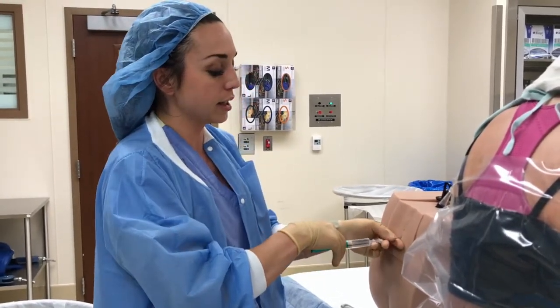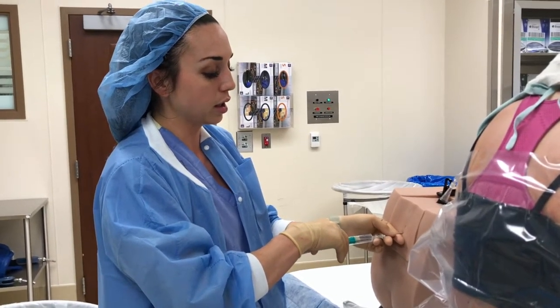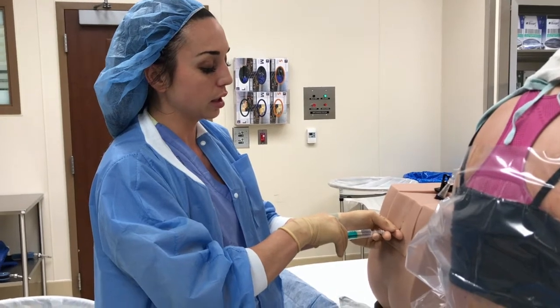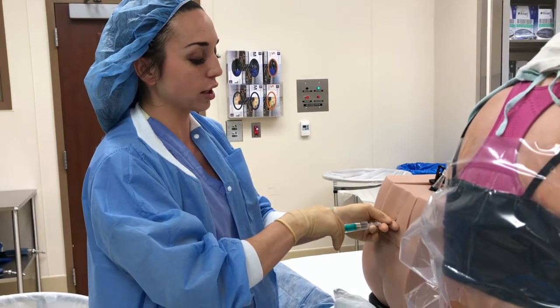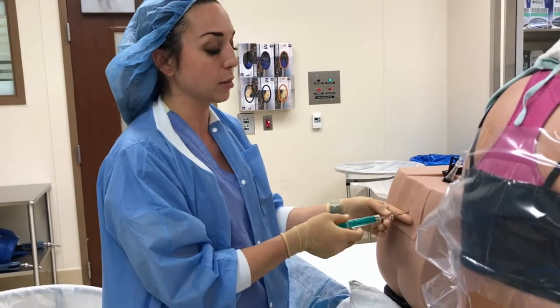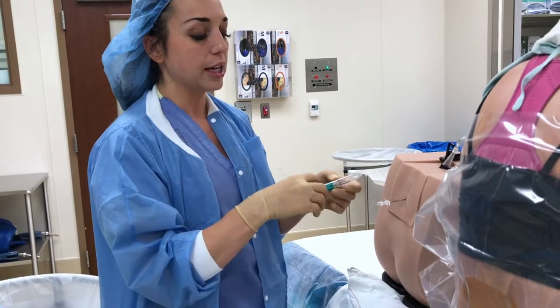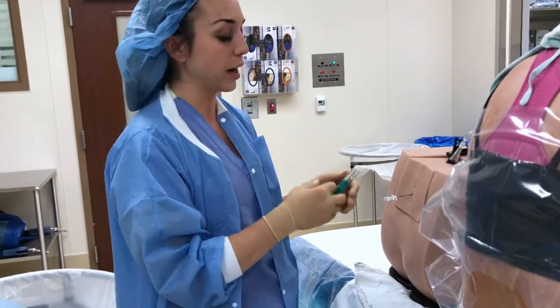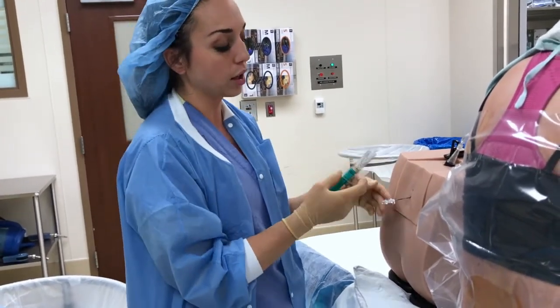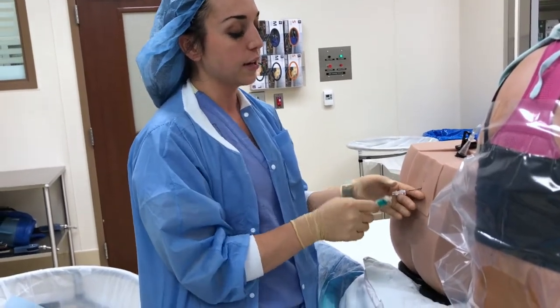So nice constant pressure with your TUI needle, so you can see that I'm advancing while I carefully am plunging down. And then you're going to hit a point where that plunger is just going to give. And that's going to be your loss of resistance, okay? So at that space, you don't want to entrain too much air either. When you get the loss of resistance, you don't want to put all that air in there. But once you feel like there's a good give of air, that's your epidural space.